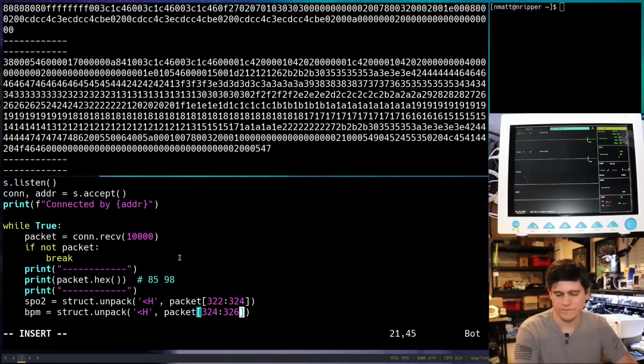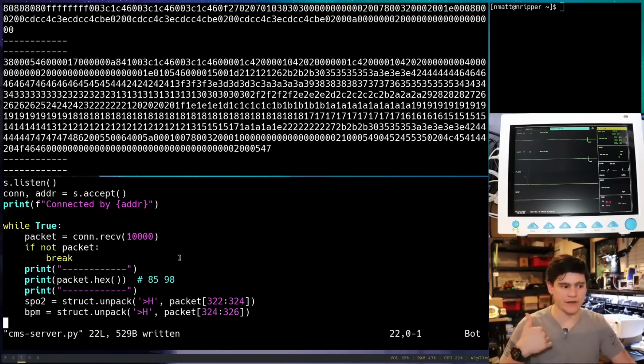All right. I think, okay, it seems like it should be like this. We're gonna find out. I don't know if that documentation is actually correct, or if I'm not understanding something correctly, because my code over on this other screen doesn't. It makes me think this is not going to work.